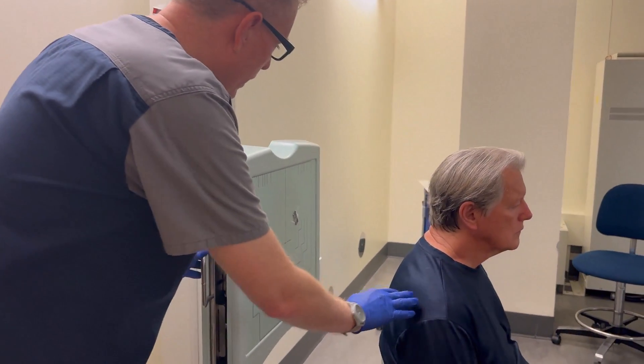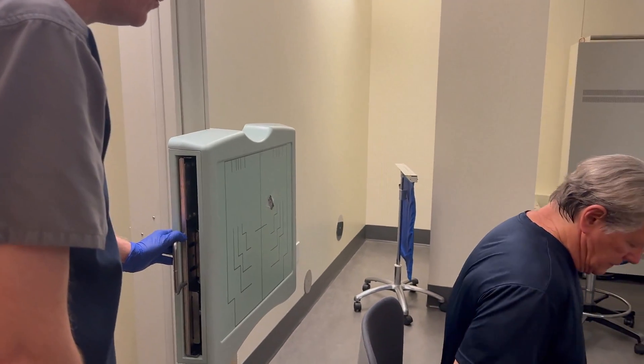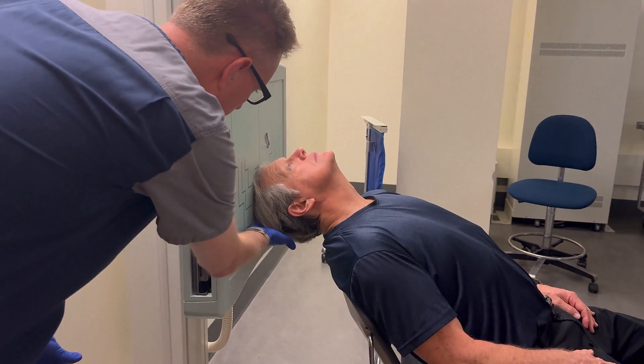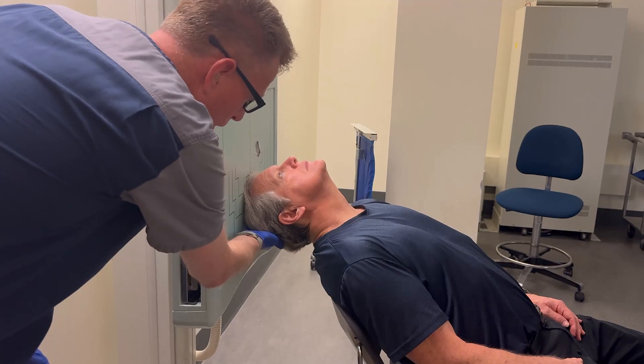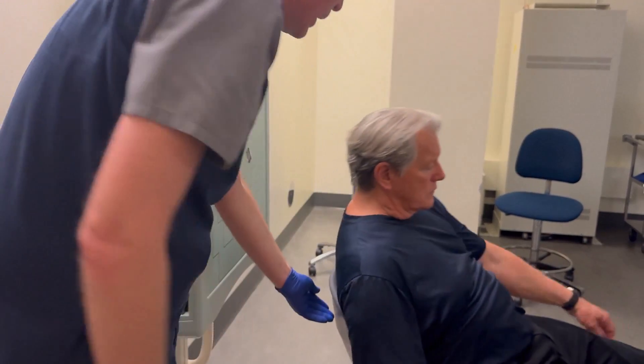Go ahead and bring your head all the way back. You may need to have them scoot their hips forward, and you may also have to adjust the chair. We've got a little more distance here between the patient and the bucky than I want, so bring your head back up and we need to scoot the chair back an inch or two.